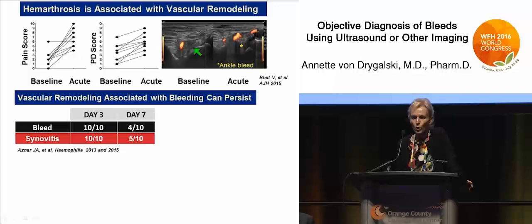Now, this is important since this vascular remodeling seems to be associated with bleeding and can persist quite a long time. And this is a study from Spain where a Spanish physician followed his patients with ultrasound after bleeding episodes and could see that half of those 10 patients still had blood lingering 1 week later and also had synovitis. He called that synovitis at the time, synovitis present with findings similar to that.